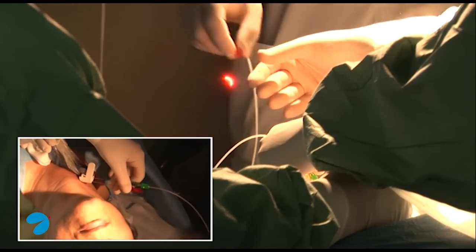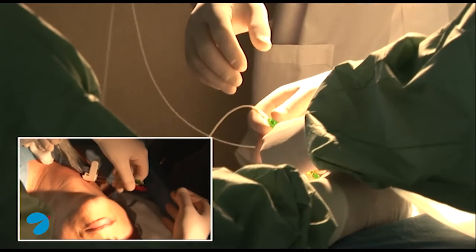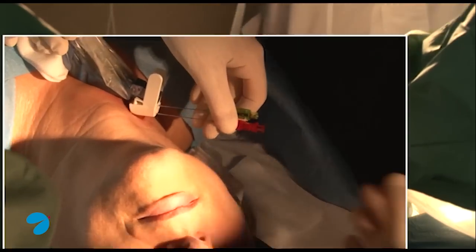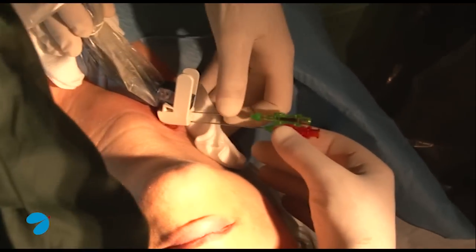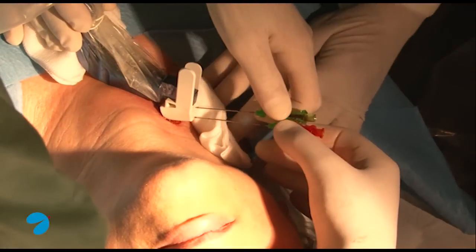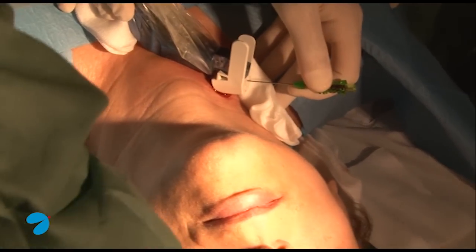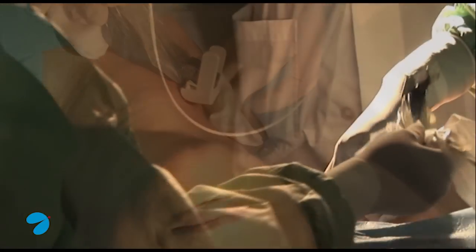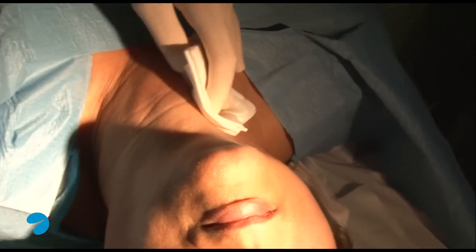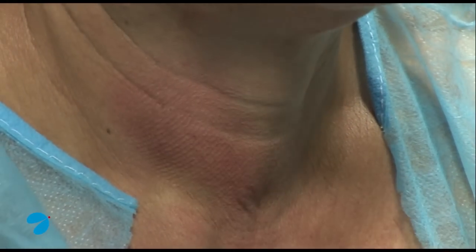We take out fibres. We remove needles. We apply a soft pressure to the patient's neck. We can see the absence of scars due to the treatment.